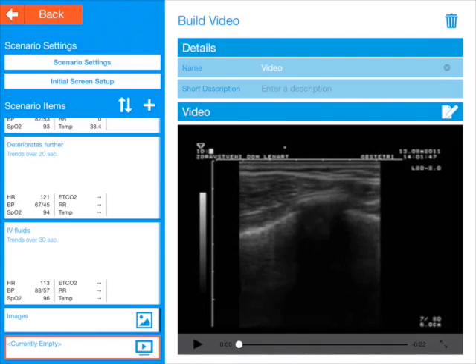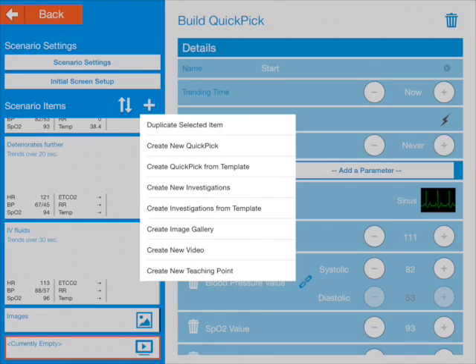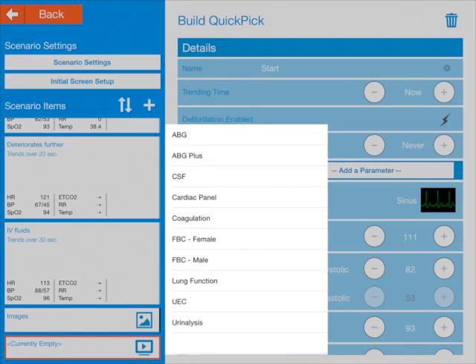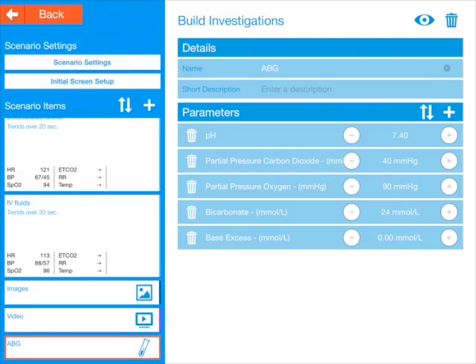Let's add some investigations — we press the plus button. Now for investigations there are two options: new investigations and investigation from template. I'm going to do from template. You can see we've got a couple of templates stored there already. Let's choose the ABG, the blood gas. As you can see, there are some default values which pop up, and we can alter those as required. When a value goes outside the normal range, it will actually turn red.